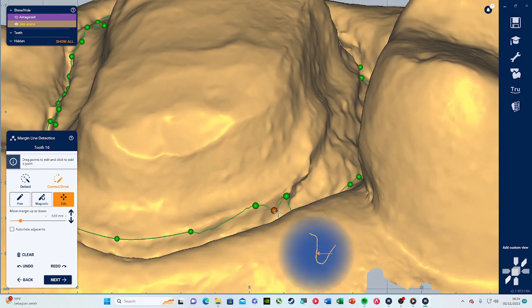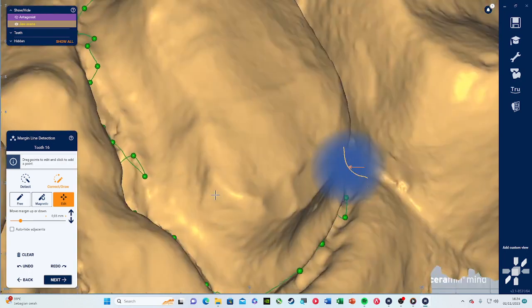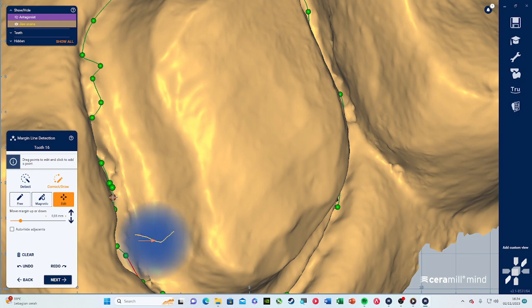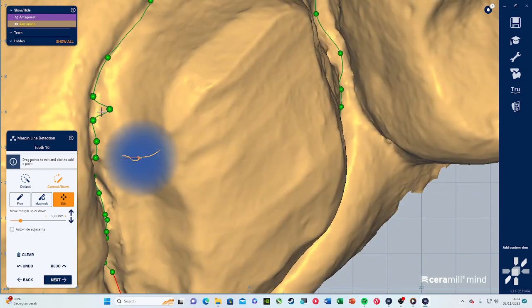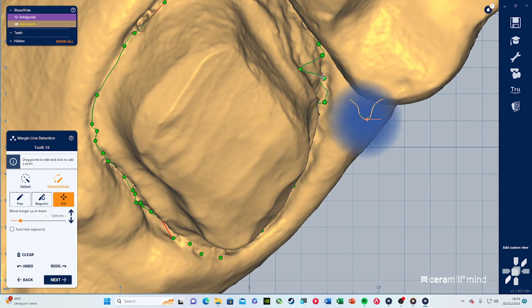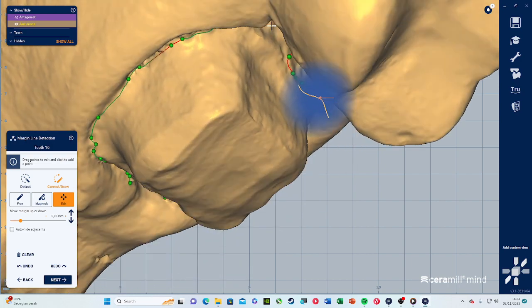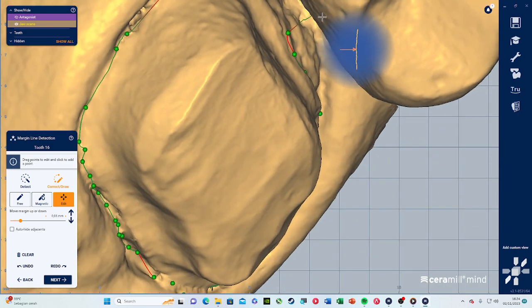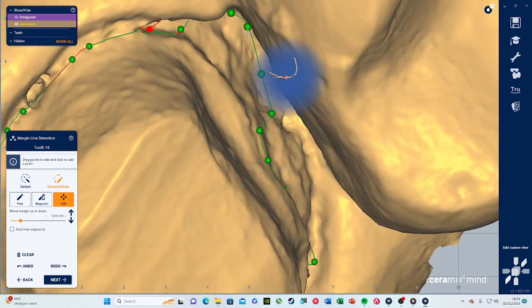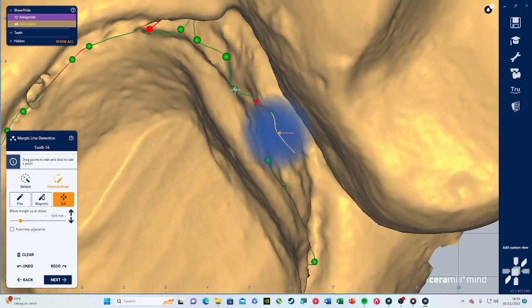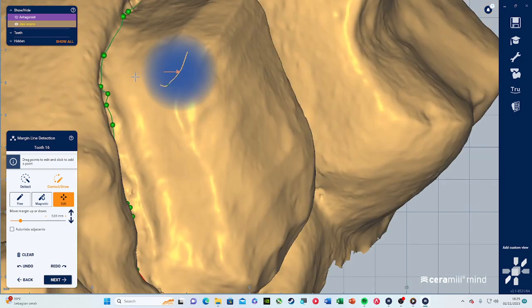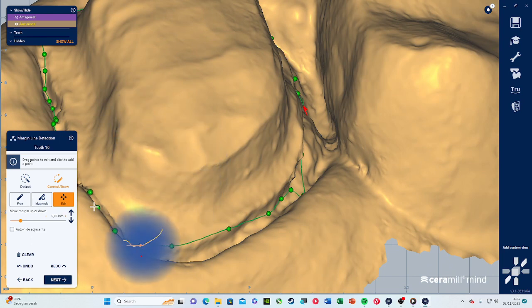If there are areas that need to be fixed you can drag the ball points around. Some points are overlapping, which will create a problem later. This margin detection should not be difficult — it depends on how well the tooth was prepared. I would drag some points up because they're too far down. This process depends on the dentist's preparation skills; since this is a practice file it wasn't as well prepared. I think that should be okay for margin definition — press next.